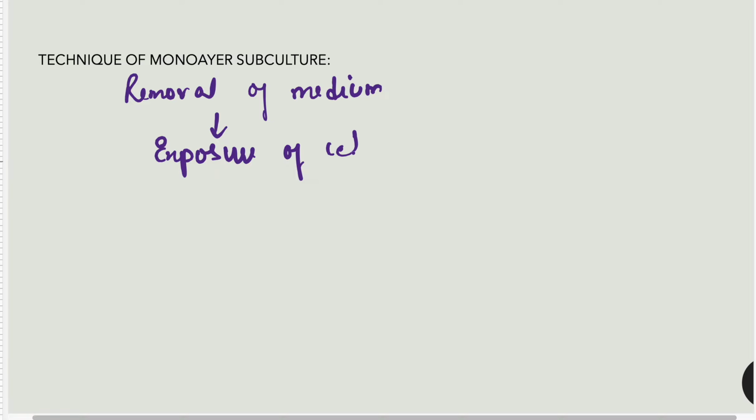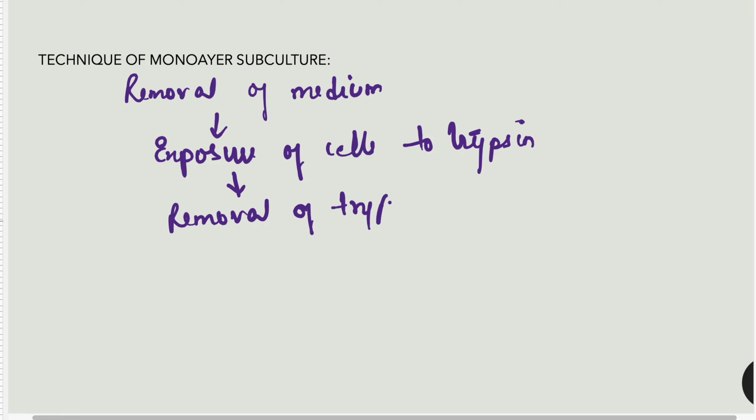Those steps we'll see. First, removal of media. Next, exposure of cells to trypsin. Next, removal of trypsin. Next, incubation to round up.